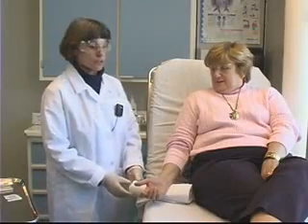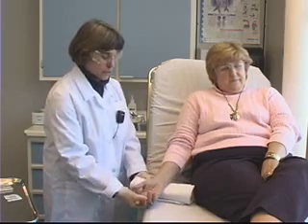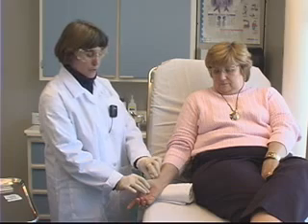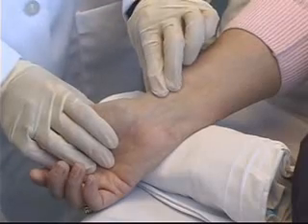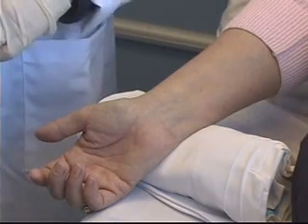I now have my patient seated comfortably on the stretcher. I'm going to tuck a rolled-up towel underneath her wrist. That will help hyperextend the wrist a little bit, which will bring the artery closer to the surface and make it easier to palpate. I'm going to feel for the artery again — that's right there — and the first thing I need to do is clean the area.